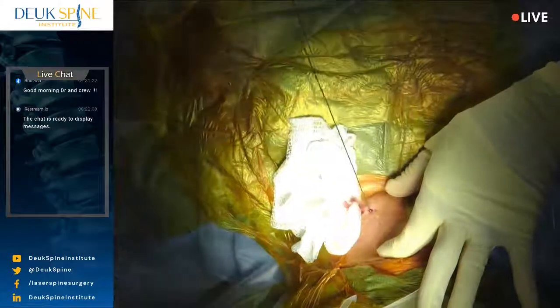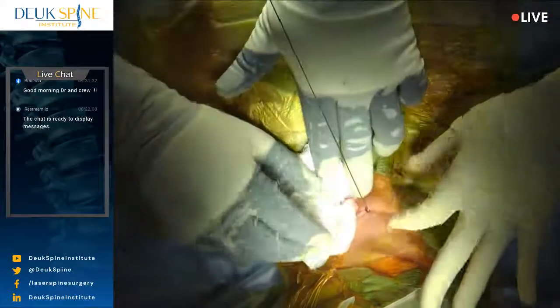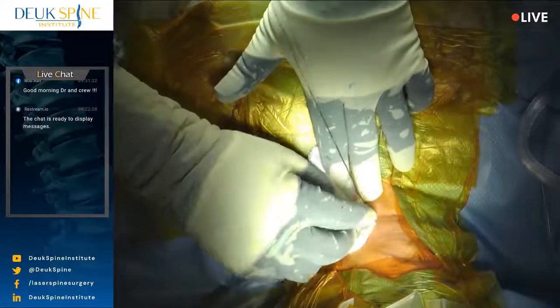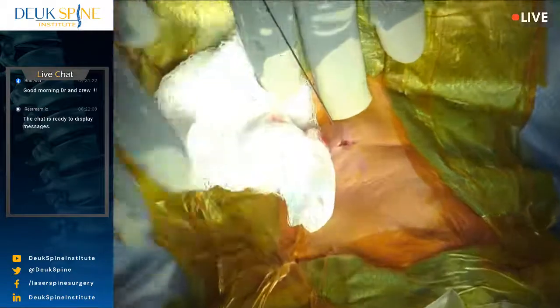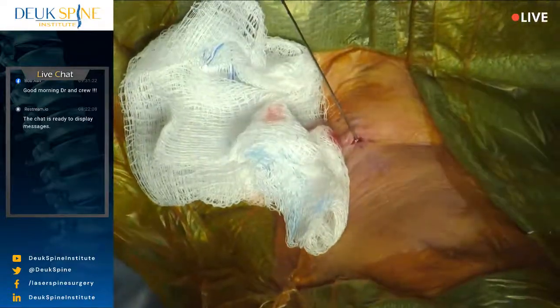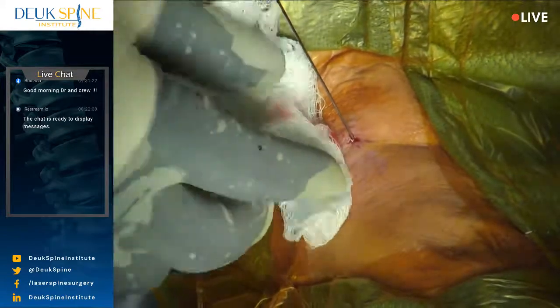So we're making a 4 millimeter incision. You see that, Zach? You want to zoom in on that? I've just made a 4 millimeter incision. And that, you imagine that's going to heal really well. Now think about, what would an ACDF look like? You know, an ACDF is the alternative surgery.